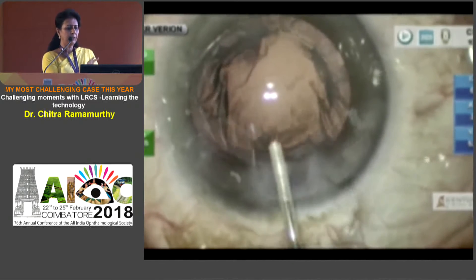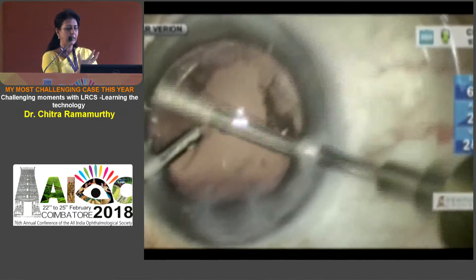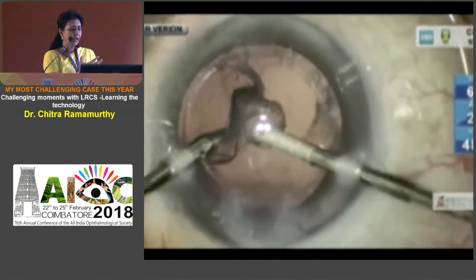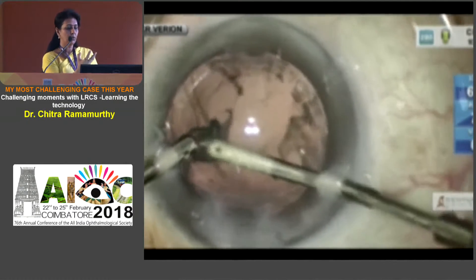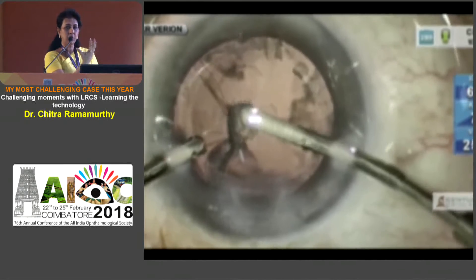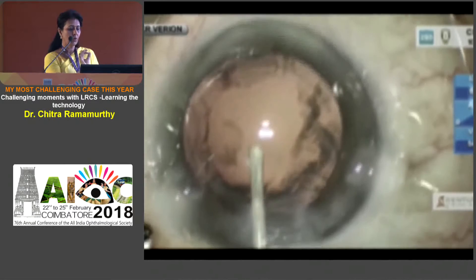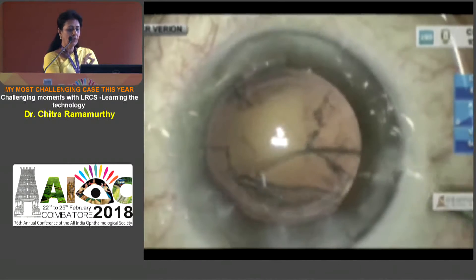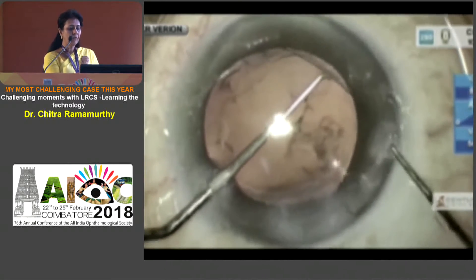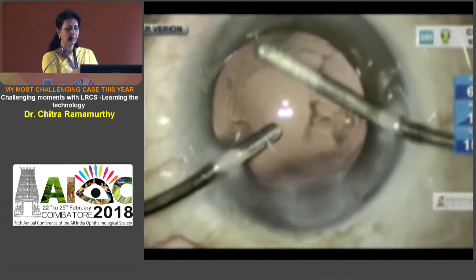With absolute ease I'm removing the cortex. I just thought I would inflate the bag at this point of time, and lo and behold, the whole capsule comes forward as if it's an intraoperative hard eye. Then I realized why — it was a lax capsule and there was an area of dialysis, and hence the whole bag had come forward. My forceps got caught, so I just release it. Now is the time to inflate the bag and go in with the CTR through the sideport and insert it into the capsule fornices.